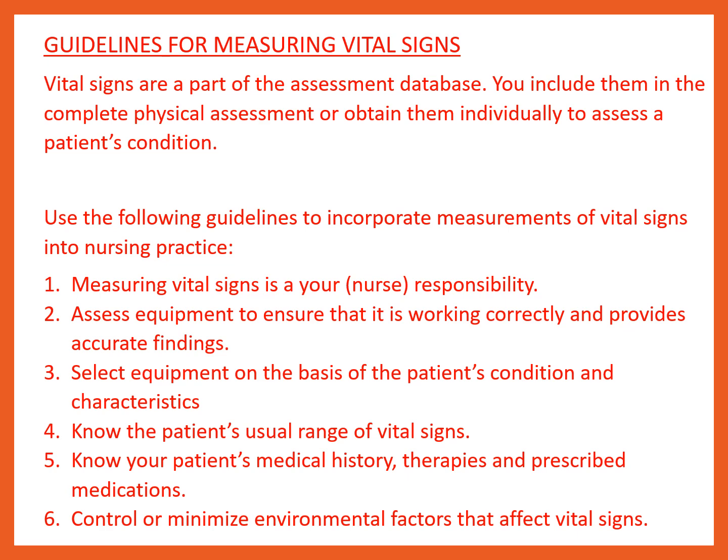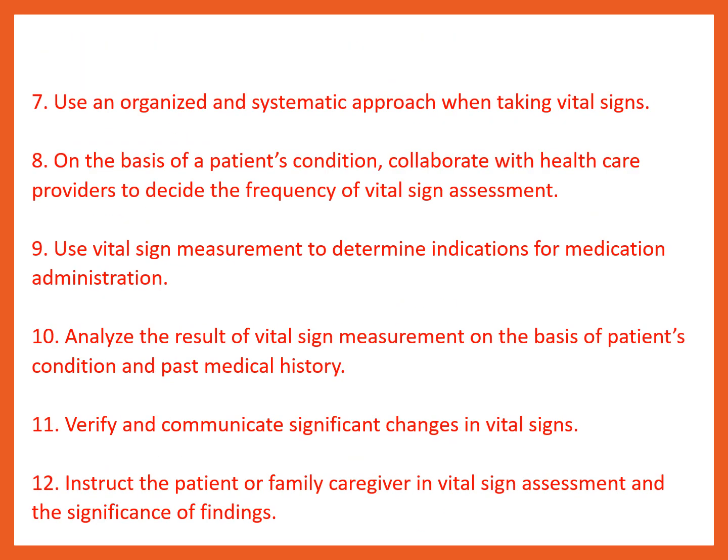For example, assessing a patient's temperature in a warm, humid room may yield a value that is not a true indicator of his or her condition. Number 7, use an organized and systematic approach when taking vital signs. Each procedure requires a step-by-step approach to ensure accuracy.